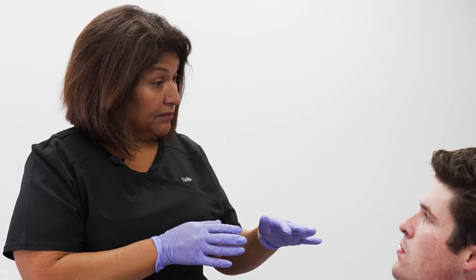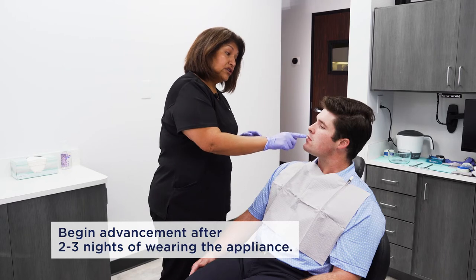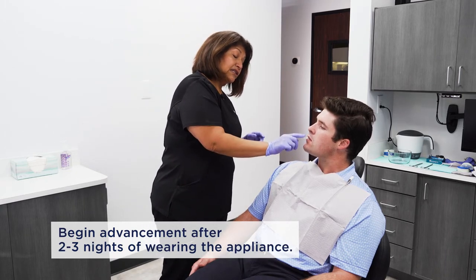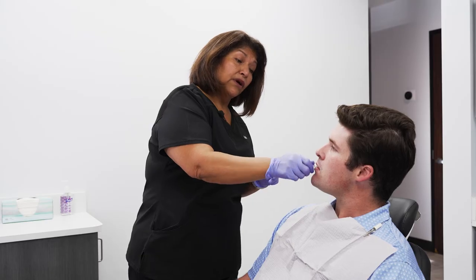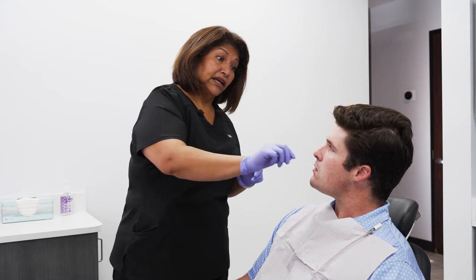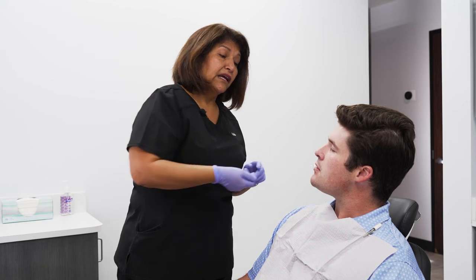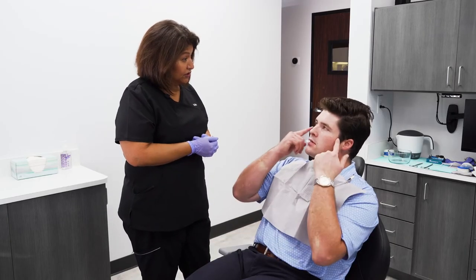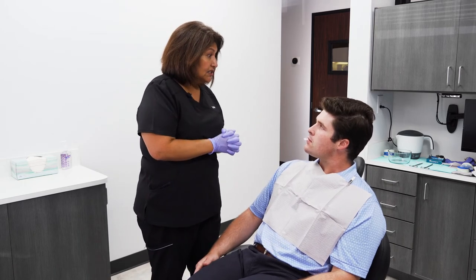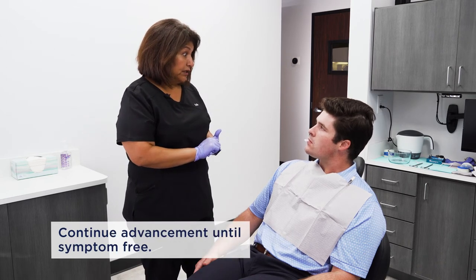You're being pulled forward some here, but what you're going to do after the second or third night of wearing it is start adjusting the jaw even further forward. You're going to do that by twisting this little dial towards your left one half turn, so the dial just has to go back to being leveled. You can feel a little more stretch in the jaw. We don't know how many times you need to adjust it — you just adjust it according to the comfort to your jaw and the clearing of the snoring.